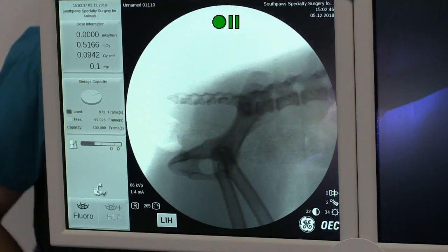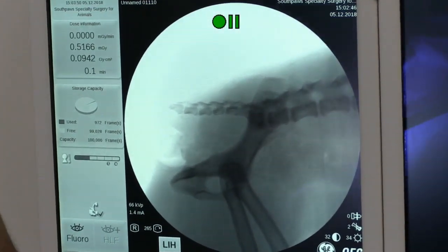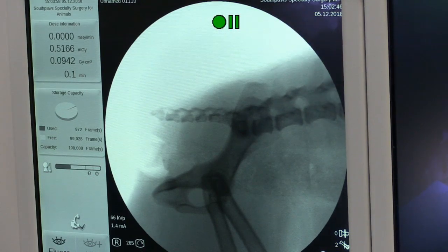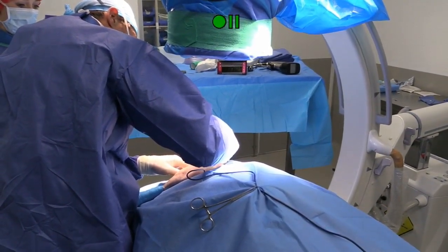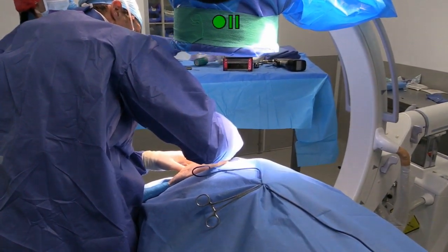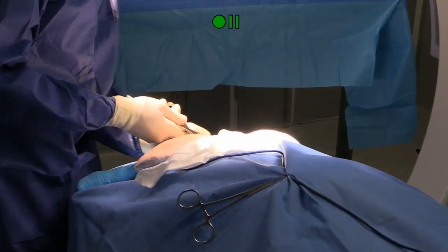So we're just going to do a little approach down on the ischium to grab on there with the bone-holding forceps. If you didn't hear that, James is making an approach to the ischium just so he can grab onto the bone with a bone-holding forcep. That's going to allow him to position the ilial wing more anatomically in the spot that it's meant to go.